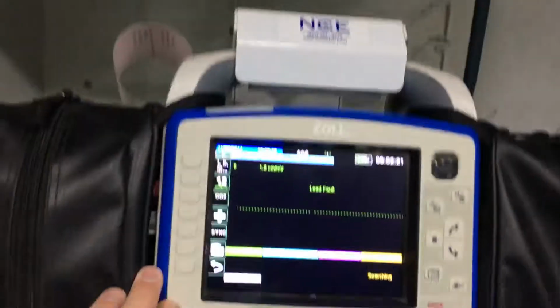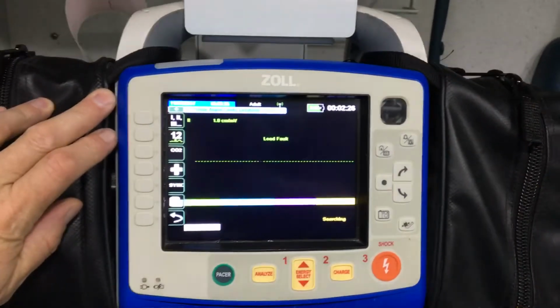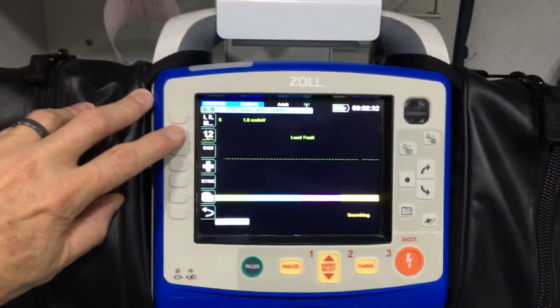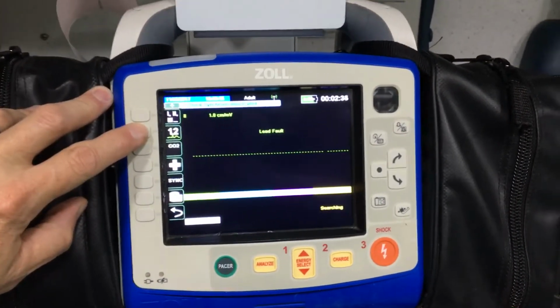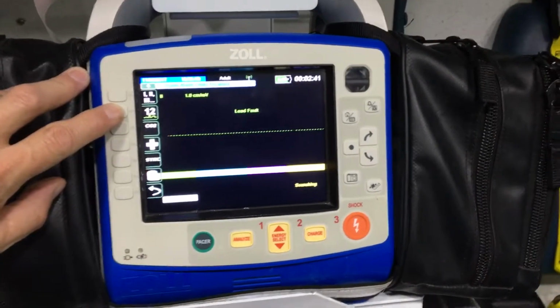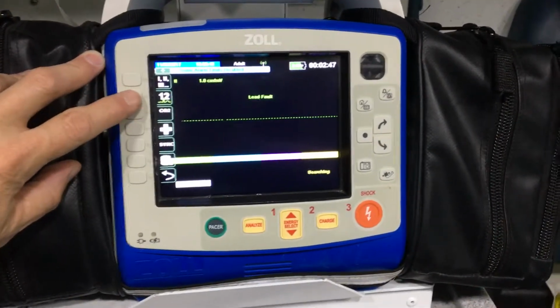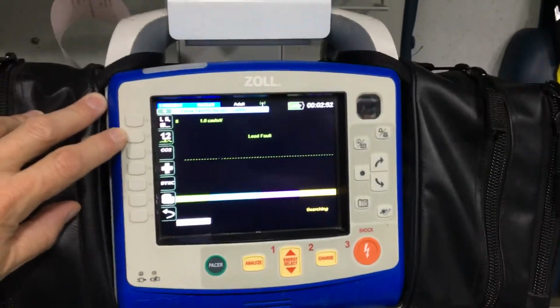So we'll go back and we'll do a 12 lead to transmit to Liberty. Right now that's the only hospital we can transmit to. They have the RescueNet software on a computer that's, they said, real close to the phone that we call in on, and when we send a 12 lead to it, they said it will beep and make noise so they know something has come in. When you give a report, just mention that, hey, I transmitted a 12 lead, and if they haven't found it yet, then they'll know to go look for it.